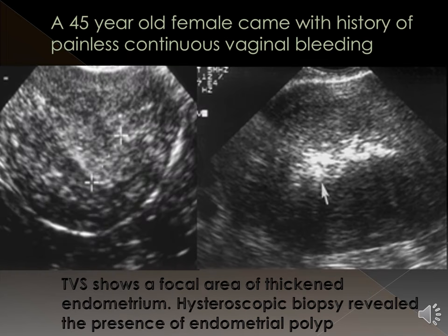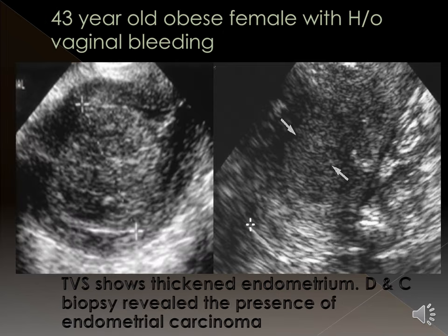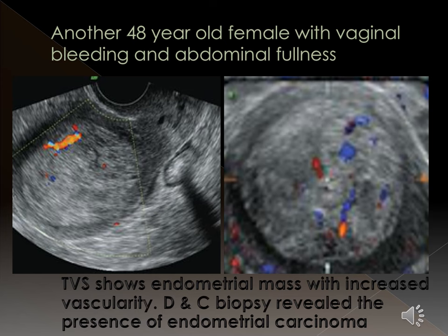A female came with a history of painless continuous vaginal bleeding. On TVS, it shows a focal area of thickened endometrium. Hysteroscopic biopsy revealed the presence of an endometrial polyp. Next, an obese female with history of vaginal bleeding. On TVS, it shows thickened endometrium. DNC biopsy revealed the presence of endometrial carcinoma.